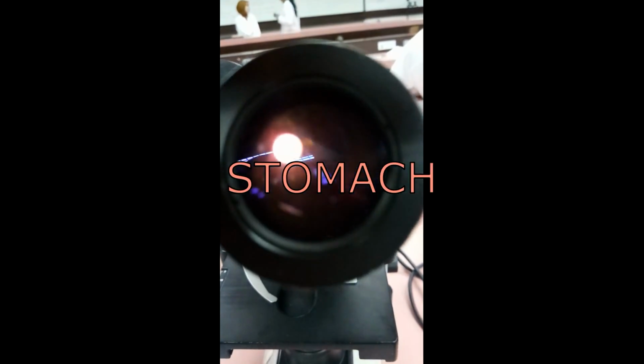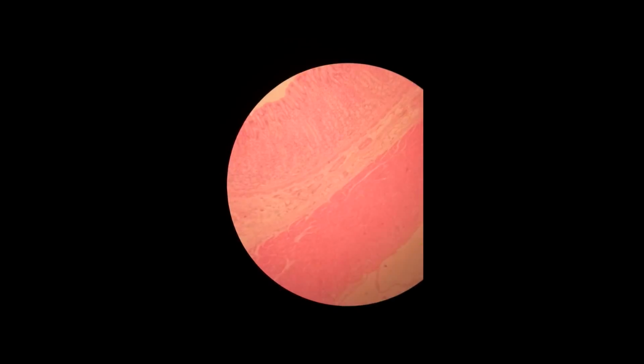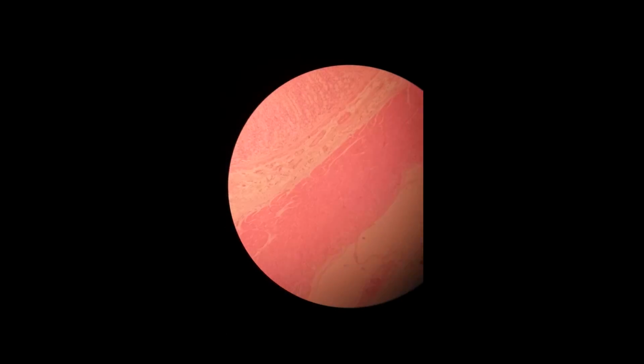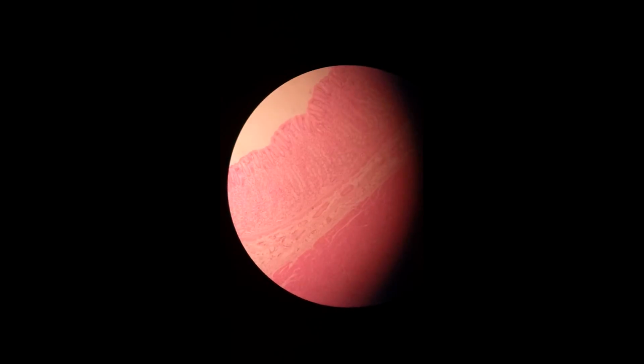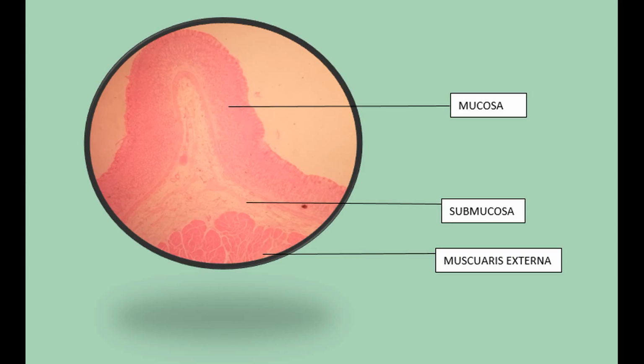Okay, the next slide is the stomach. The stomach is a muscular sac that is located on the left side of the abdominal cavity, just inferior to the diaphragm. This major organ acts as a storage tank for food so that the body has time to digest large meals properly. The stomach also contains hydrochloric acid and digestive enzymes that continue the digestion of food that began in the mouth. Okay, from the observation, we can see the layer of mucosa, submucosa, and muscularis externa.